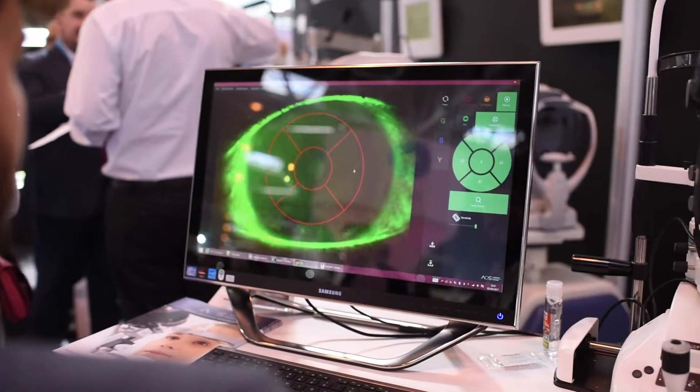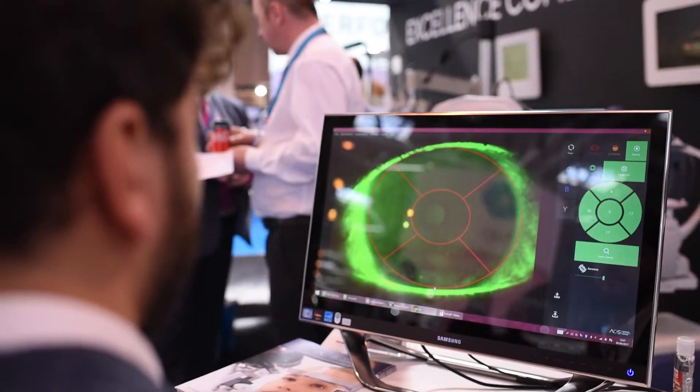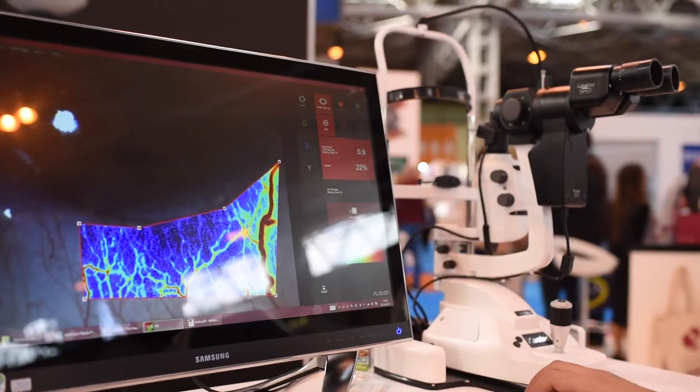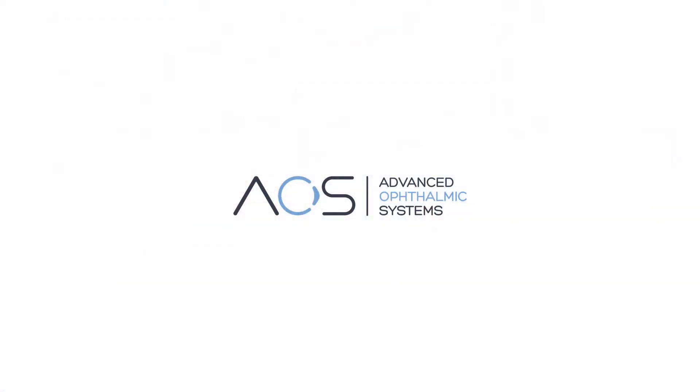Scleral lens fitting involves putting a lens onto the conjunctiva, which is ribbed with blood vessels. You don't want those blood vessels compressed in any way. You can sort of see a bit of whiteness here and a bit of redness there, but with the AOS software you absolutely get a measurably different area inside and outside the lens — you can tell whether there is perfect normal flow or whether there is an impinging capability, indicating that lens is not fitting ideally. Simple things that make chair time easier, enable better lens efficiency, and let you map and track changes in any condition — lens-related or not — over time.